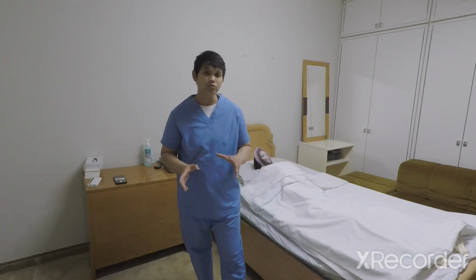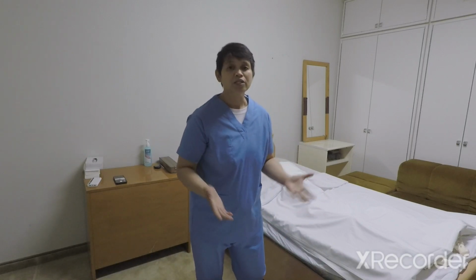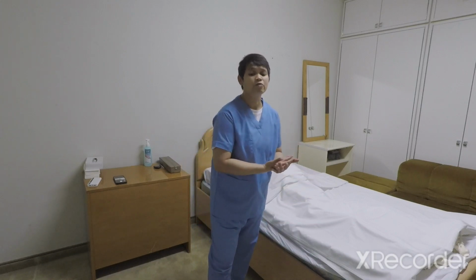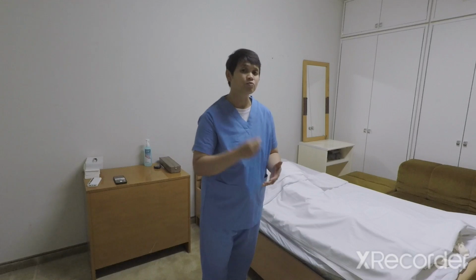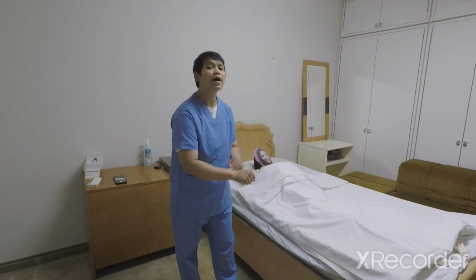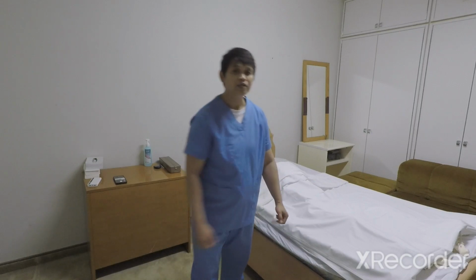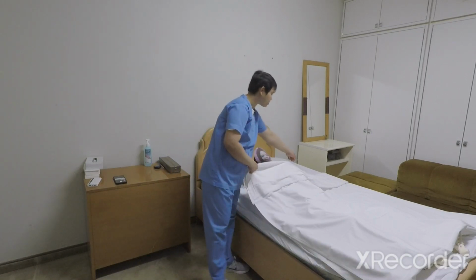Another thing you will do if the patient is bedridden is rely on the notes and the order of the doctor. We should know who the patient is and what the full name is, then check for the ID band. Okay? Now, let's start transferring our patient.